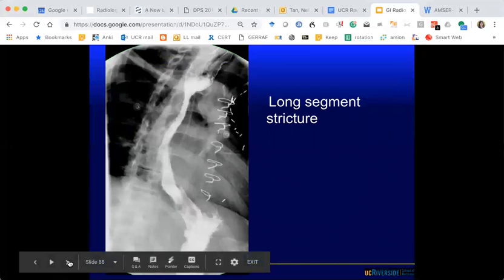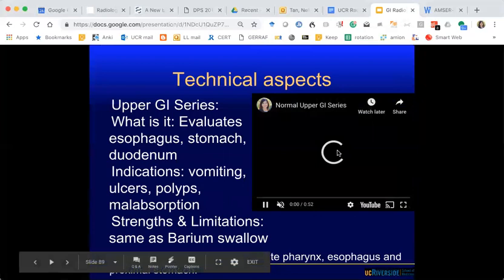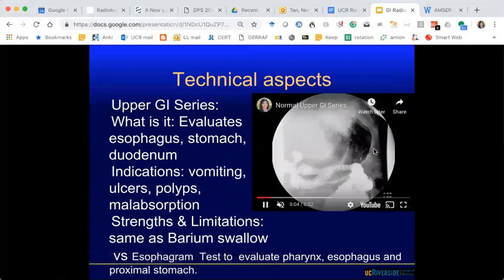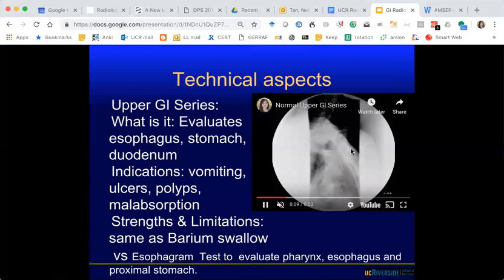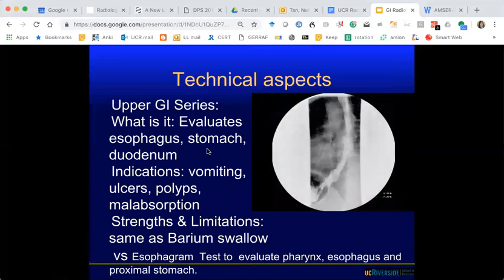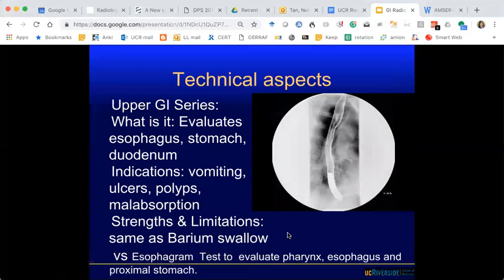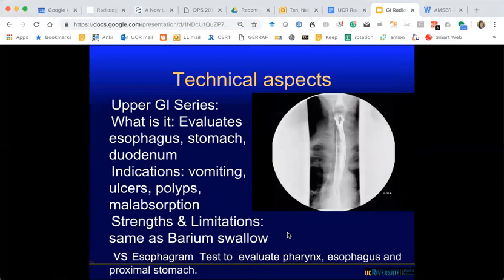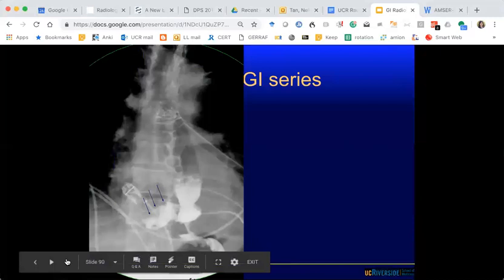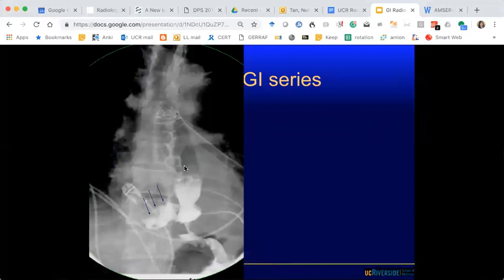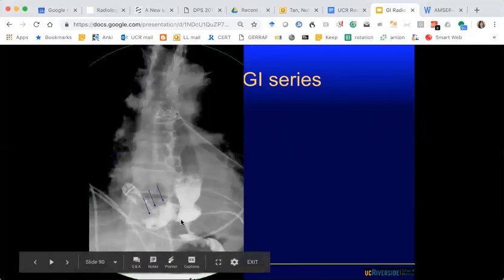Now moving on to upper GI. The difference between an upper GI and an esophagram is that upper GI also checks out the stomach. You do this when worried about vomiting, ulcers, polyps, or malabsorption. Here is an upper GI of a patient status post Nissen fundoplication — this is the wrap around the GE junction with the stomach wrapped around. There's contrast here — is that a normal location? There's a leak, so the anastomosis may not be sealed. What contrast would you use? Gastrografin or omnipaque.